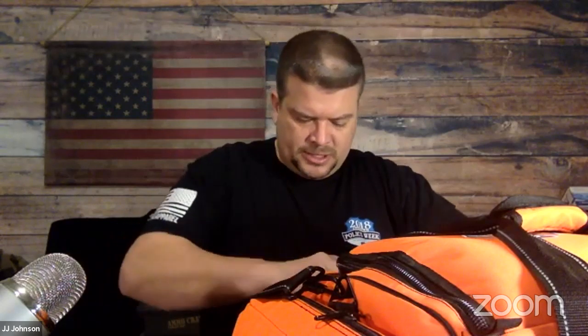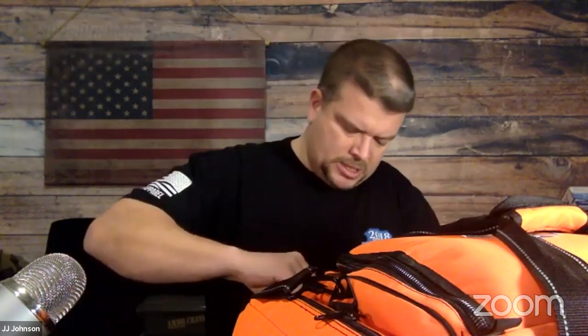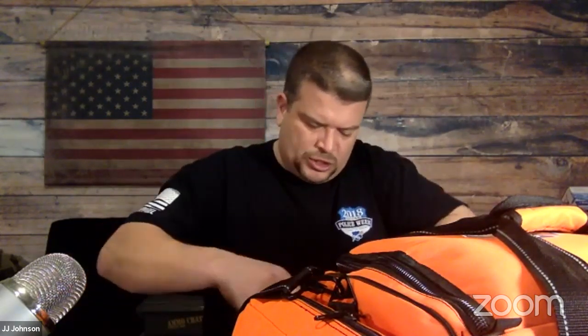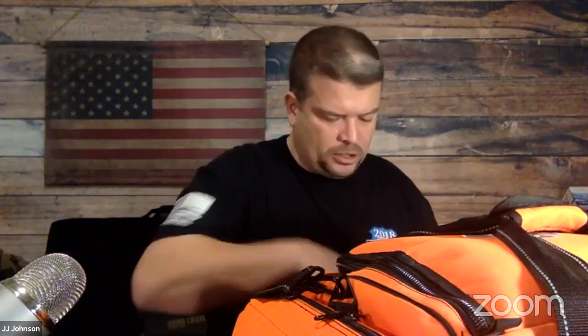So that's pretty much that first pocket. Almost. I got a couple more things. I got some duct tape just kind of rolled up on a pen or a pencil here, and again, that's good for splinting, stabilizing fingers, and that kind of thing. And then I've got just a little fixed blade knife that's pretty sharp. Okay, so I'm gonna replace those, so I'll go ahead and close this up.